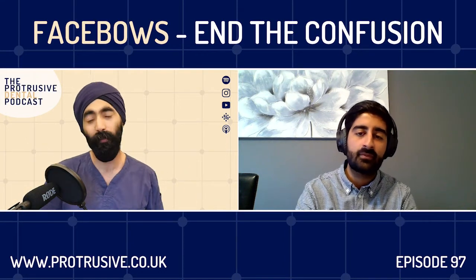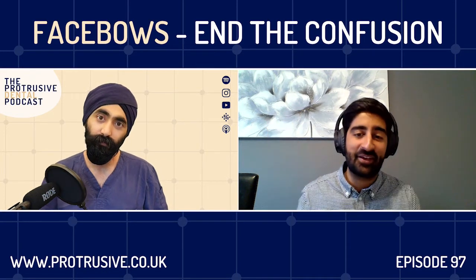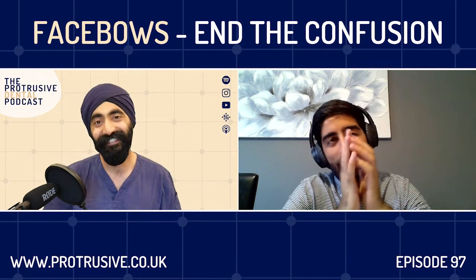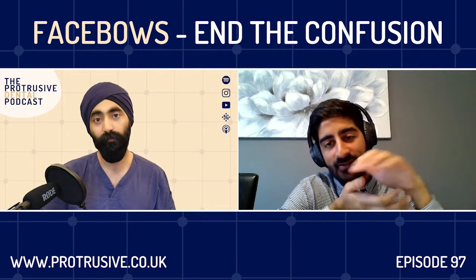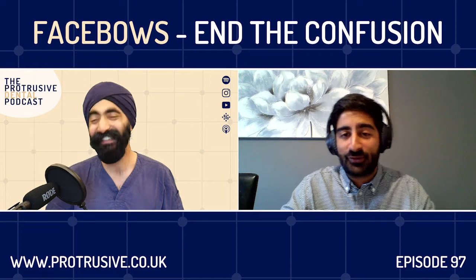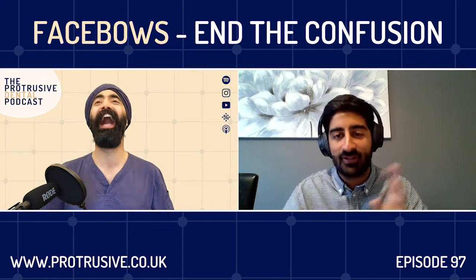Any closing comments, Salman? Even that, and this is my Eastern brain thinking again, but even that 4, 5, 6 multiple units, when that patient opens and closes, I still want a bit more information on how those cuspal inclines need to be. And so for me, it's debatable. It might not make any clinical difference whatsoever. It's that peace of mind so I can sleep at night, and I'll do a good set of provisionals and then I'll adjust from there.